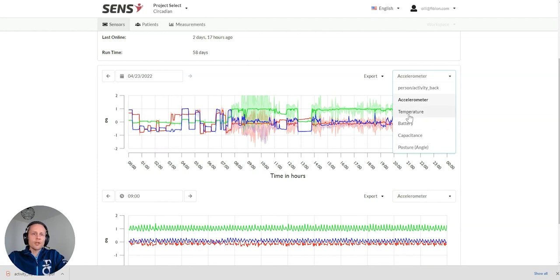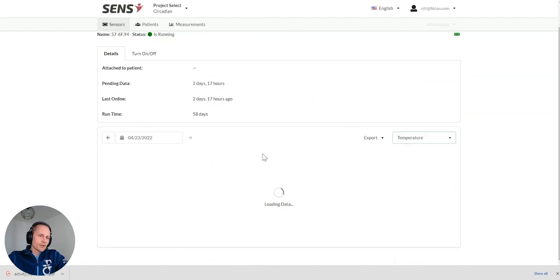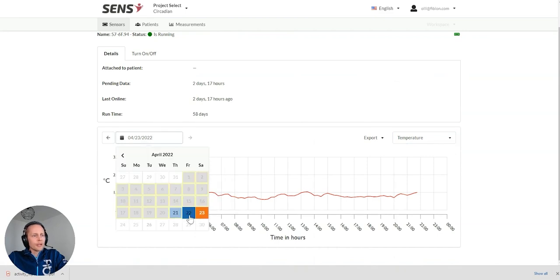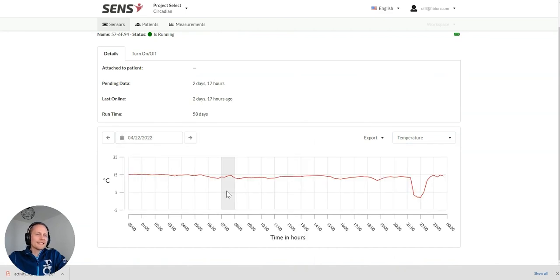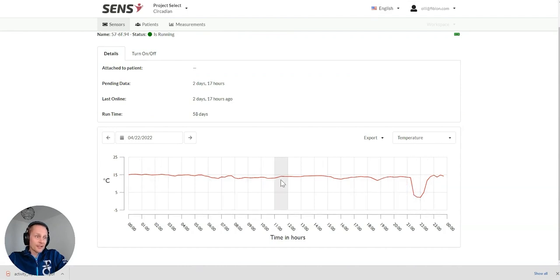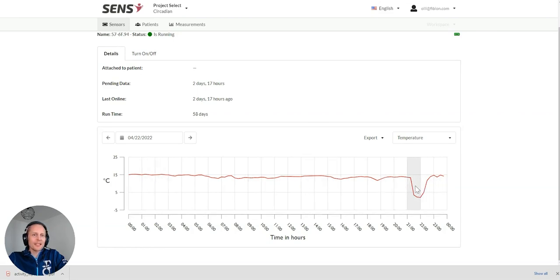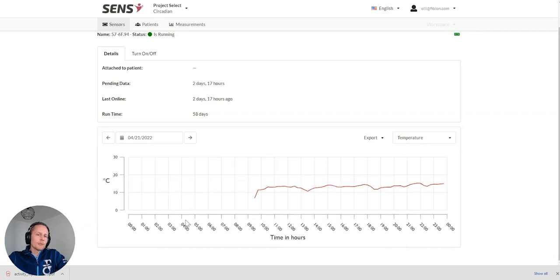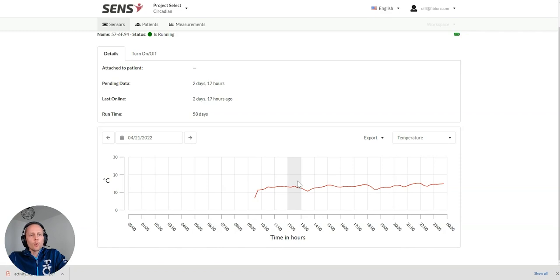And what else we can check from here? The device also has a temperature sensor. In this case, there's not much information. Maybe the person has been going outside there. It's going close to minus degrees when the person has been outside in the evening.